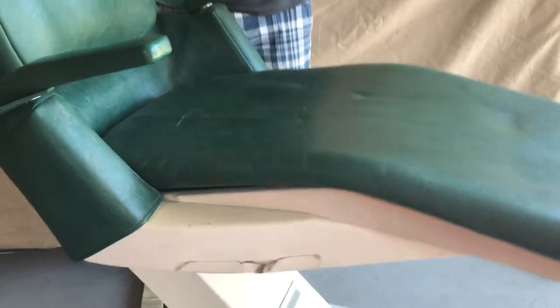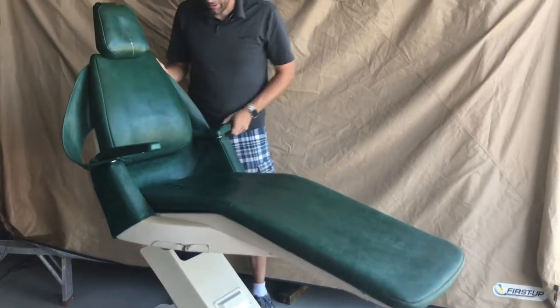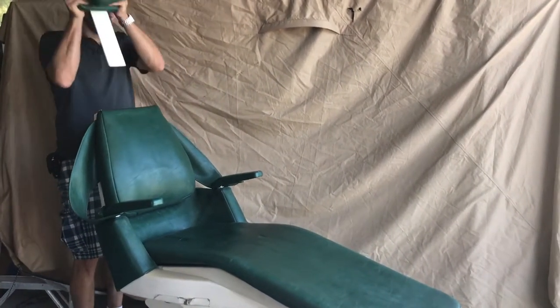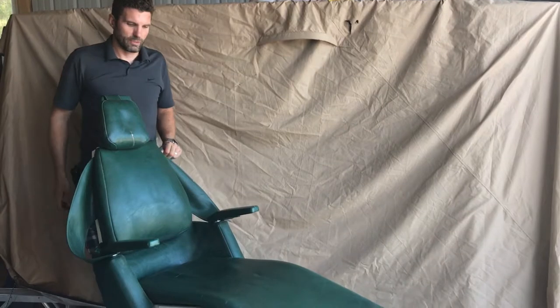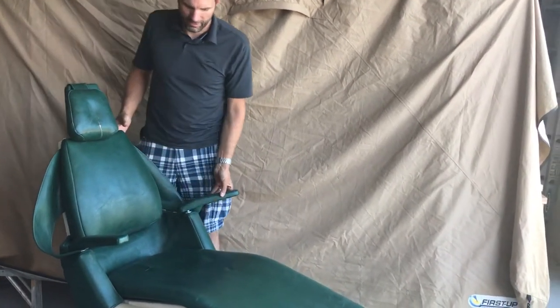Automatic return — we'll bring the patient all the way down. Arms open up to let them out, come back in. If you're working in a salon, you can take this out and work on the hair right there. And the patient can return and hop on out. Easy.